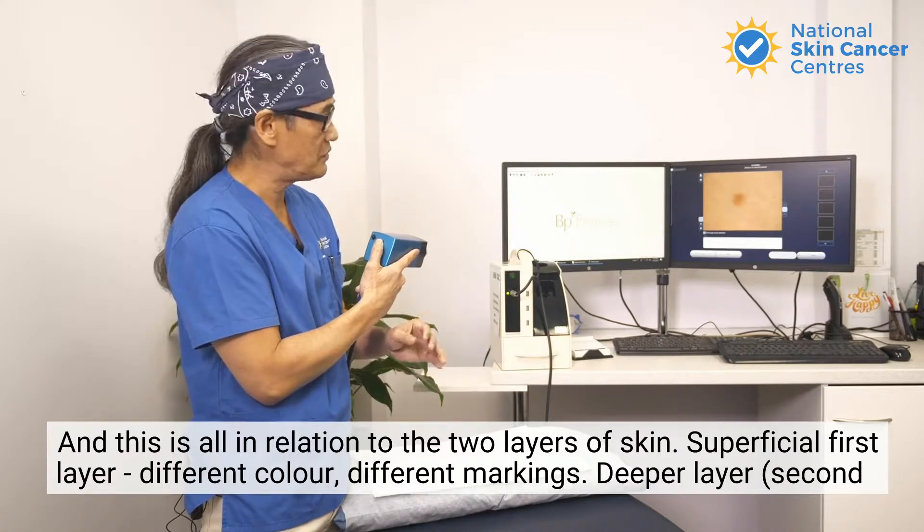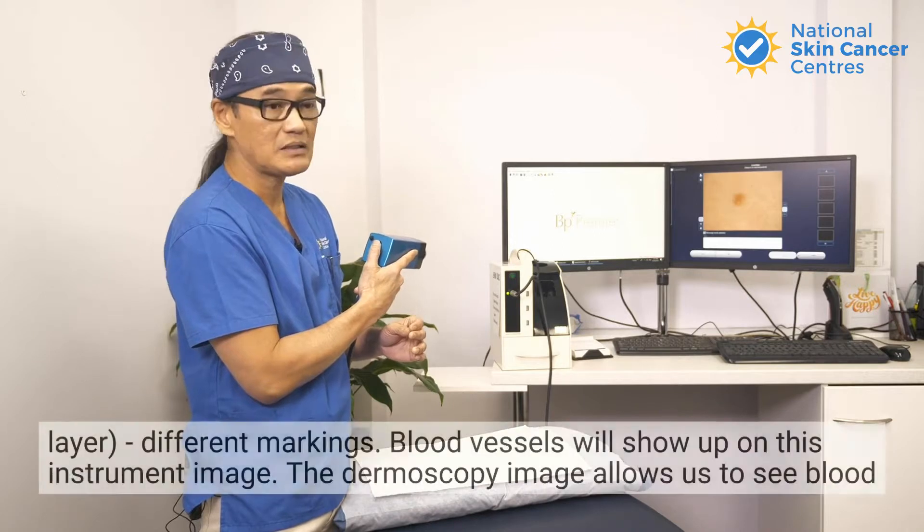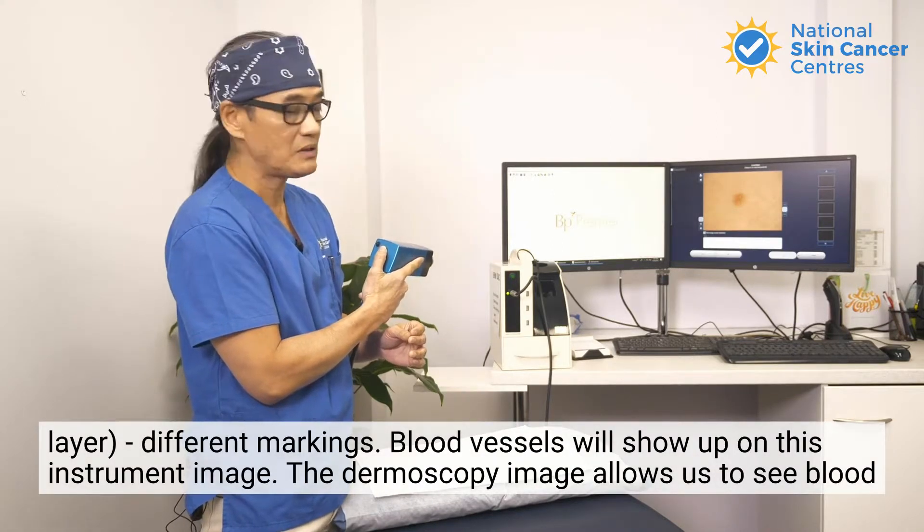The superficial first layer has a different color and different markings. The deeper second layer also has different markings, and blood vessels will show up on this instrument image.